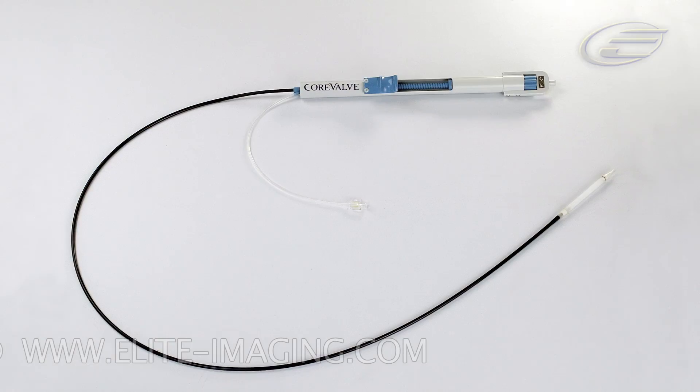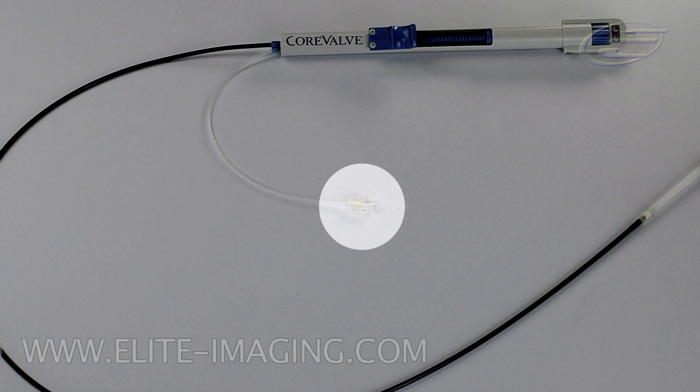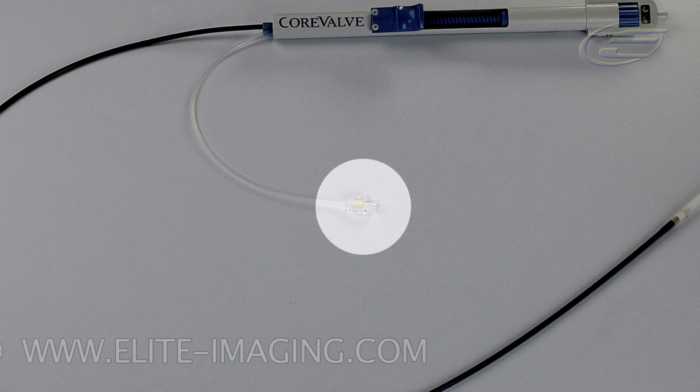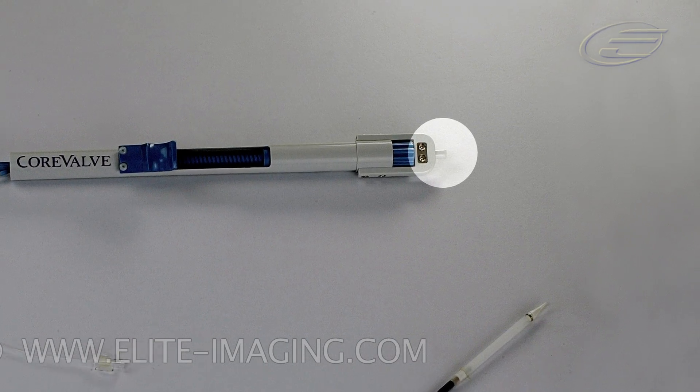Before completing the loading process, attach a 10 milliliter syringe filled with sterile saline to the luer connector on the handpiece and flush. Flush the guide wire lumen on the proximal end of the delivery catheter.